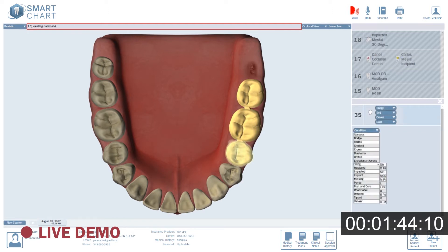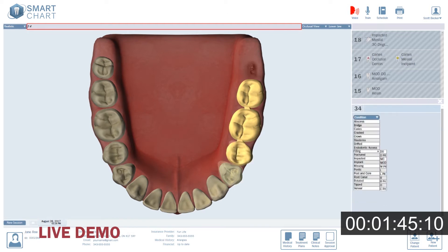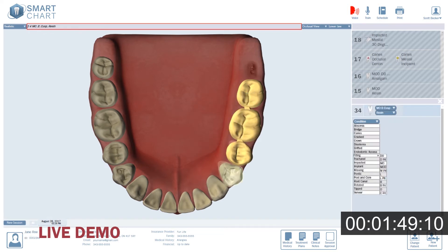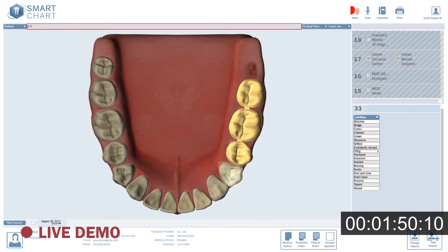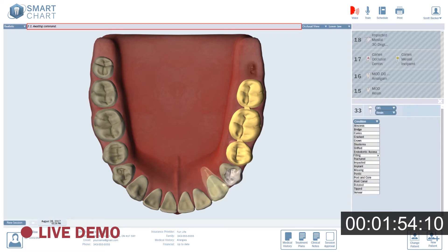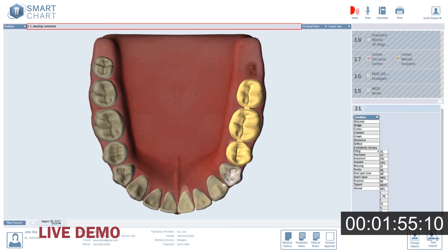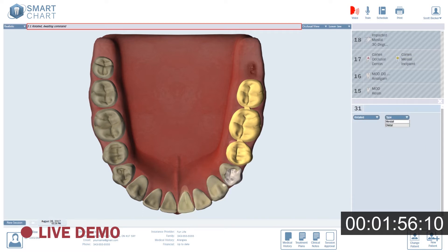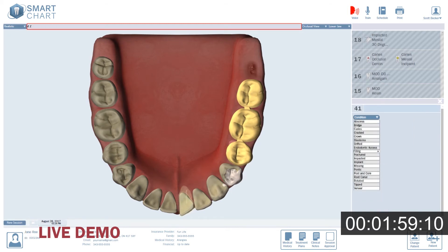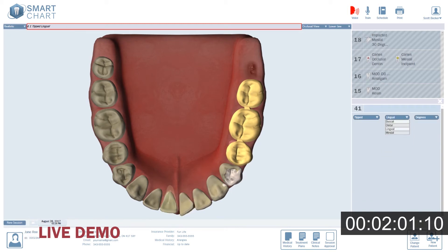3.4: MO, buccal cusp, resin. 3.3: DFL, resin. 3.1: Rotated, distal, 30 degrees. 4.1: Tipped, lingual, 15 degrees.